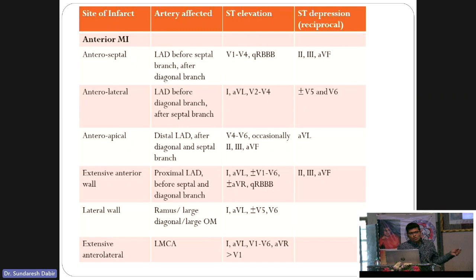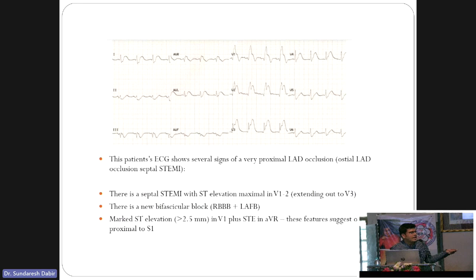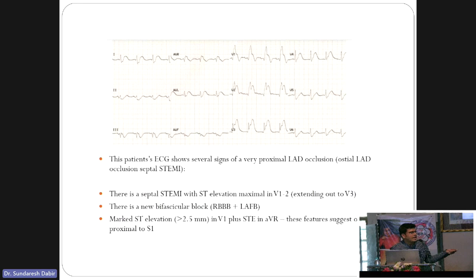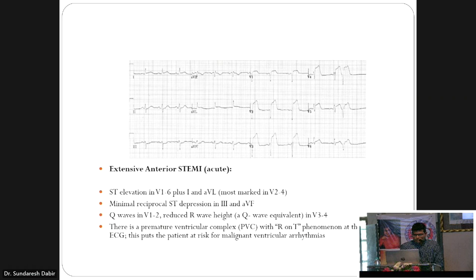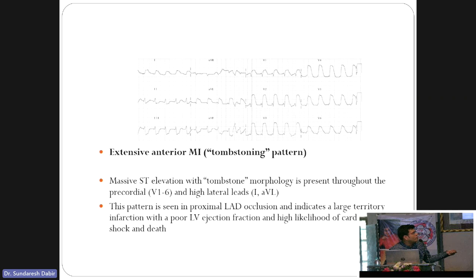ST elevation in aVR, V1 through V6, and also in I and aVL represents extensive anterolateral MI — proximal to both S1 and D1 — with the worst prognosis as most LV myocardium is involved. A classical Tombstone pattern with more than 10 mm elevation in V2, elevation in all V1 to V6, with reciprocal depression in inferior leads and elevation in I and aVL, indicates proximal occlusion of the LAD, proximal to S1 and D1.